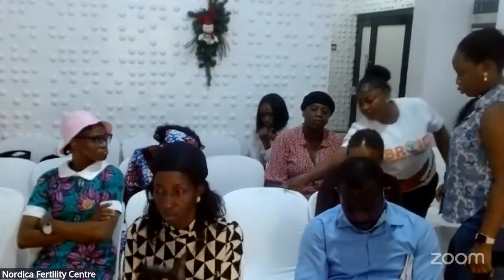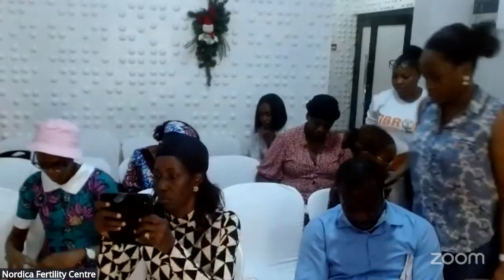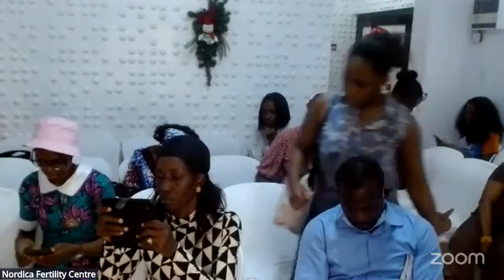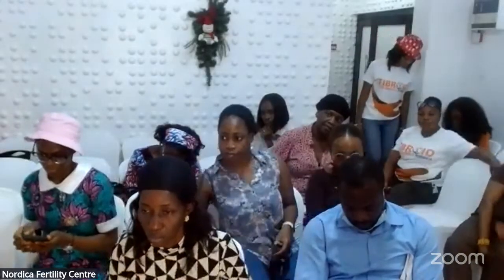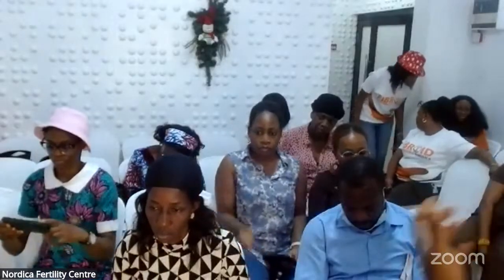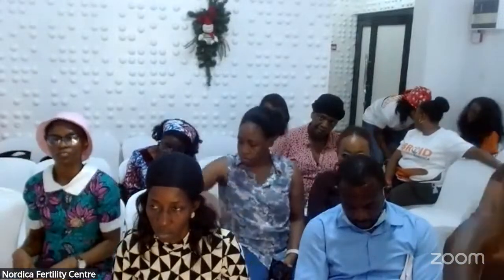So these are possible complications that can follow open surgery, which are not present with HIFU treatment. One of it is anesthetic complications. Like I said, a number of people have lost their lives as a result of general anesthesia. Now, bleeding, because you are cutting the uterus, sometimes the surgeon may find it difficult to arrest the bleeding.